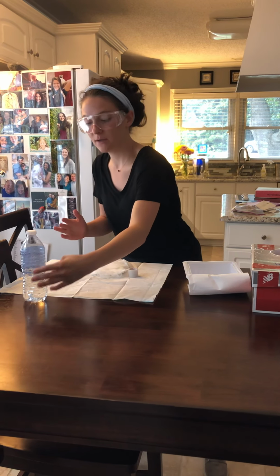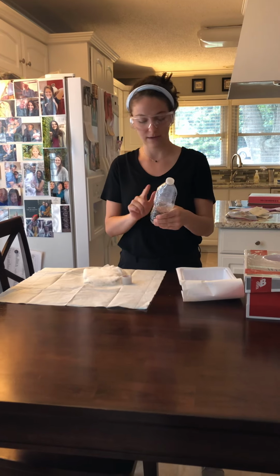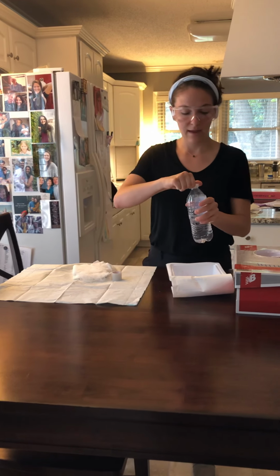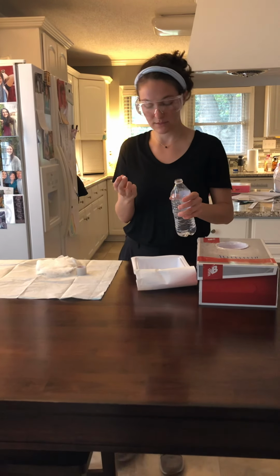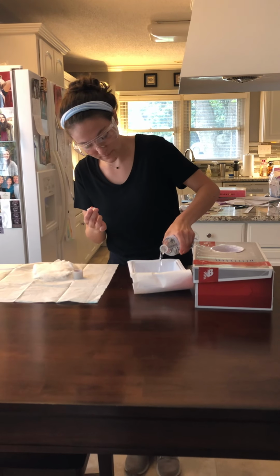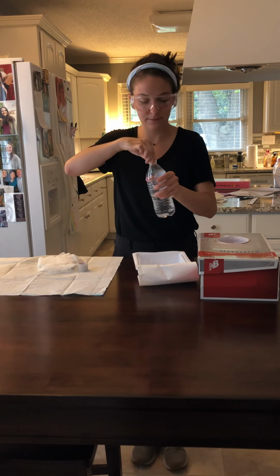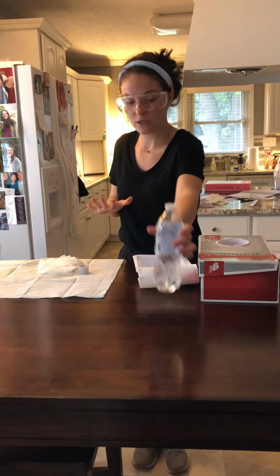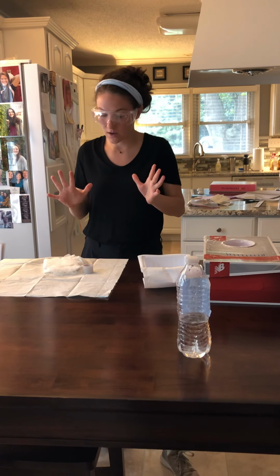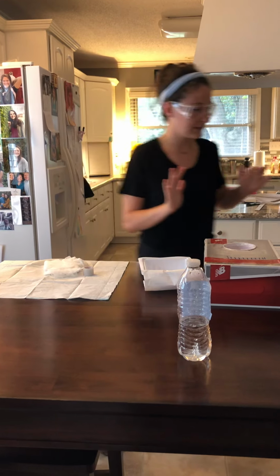And now I'm going to pick up my saline solution, and I see that it's not expired yet, so I'm going to palm the label, open the cap upwards, and slowly pour the saline into my change tray. Okay, and cap it. Did not splash anywhere. All right, now I'm going to don my sterile gloves.